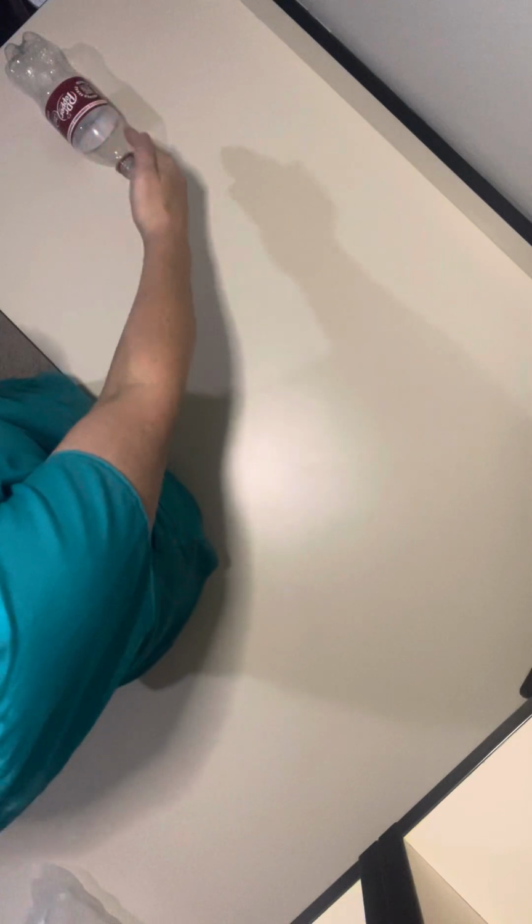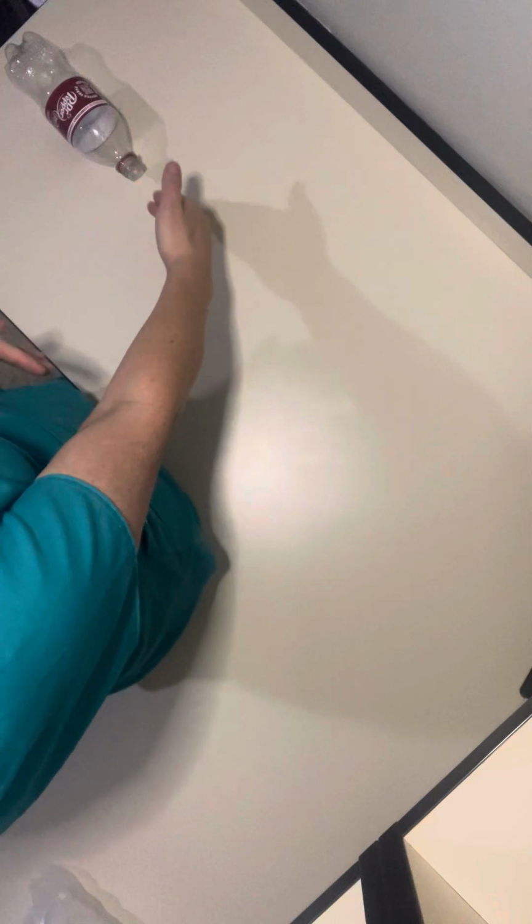Get it wet and dampen it. And as I wiped the patient, I would go this way, straight down. And then I would change to another corner and fold it around my finger. And then I would go this way. And then I would change to another corner and go this way. And then I would rinse the rag, dry the patient, remove all the equipment, clean the area, and prep it for catheter insertion. Then I would wash my hands again.